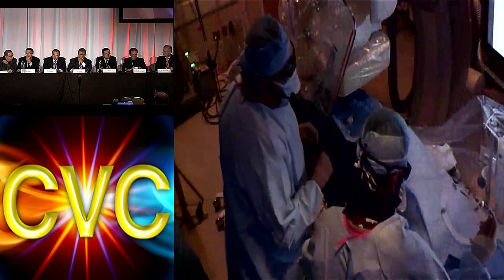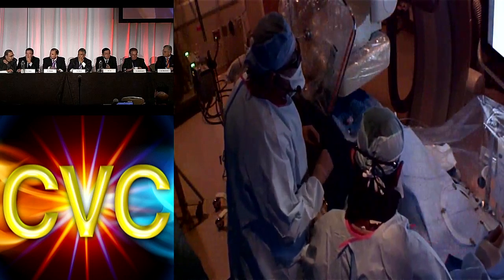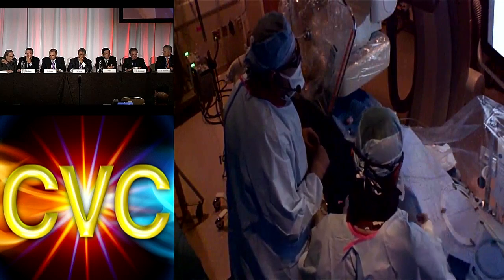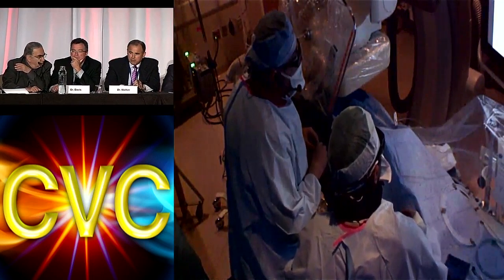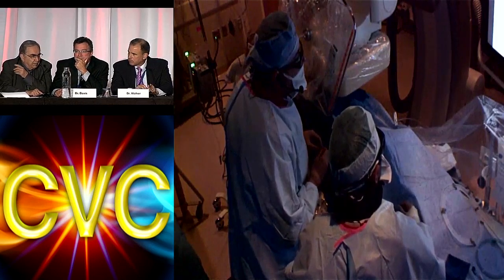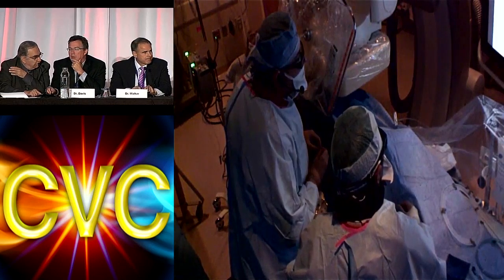Do you use the extra support or the soft? Sorry, I didn't get that. Do you use the extra support glide wire or just the soft? No, at this point I use soft.